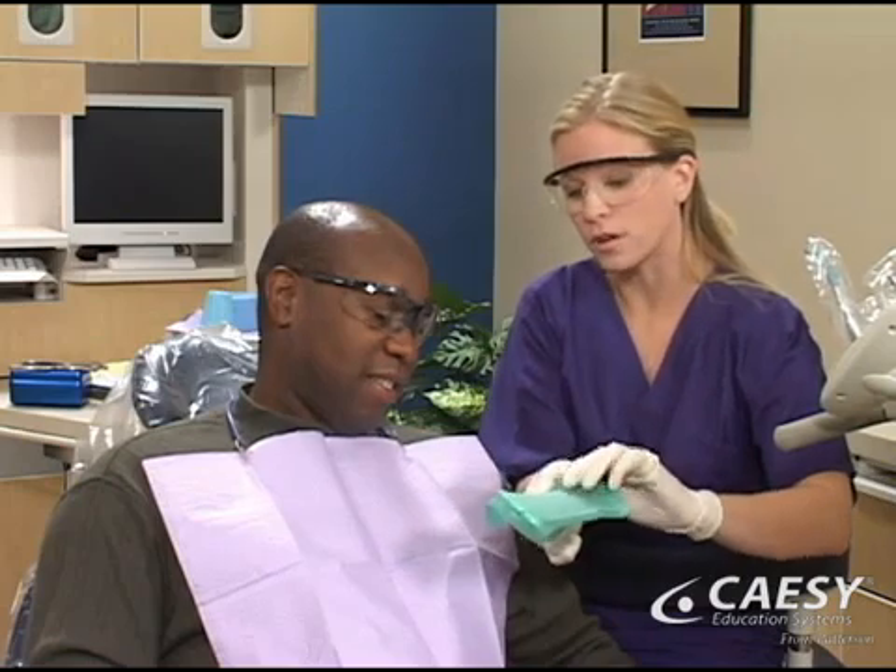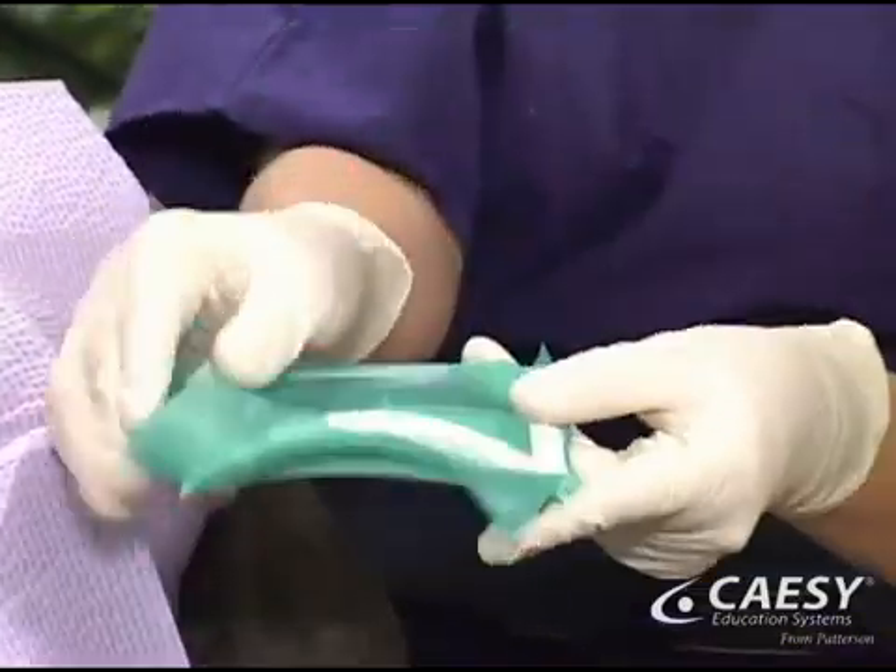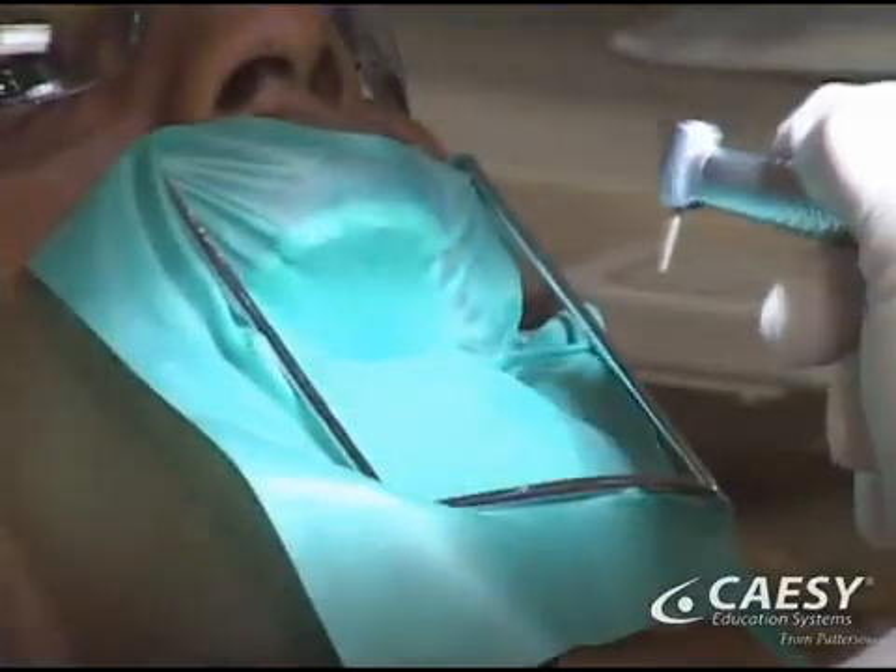Our first step is to numb the area to make you comfortable. We may also use a rubber dam to protect your mouth while we work.